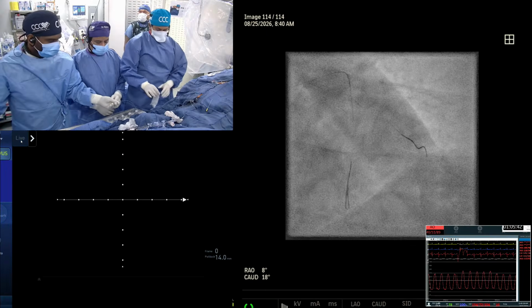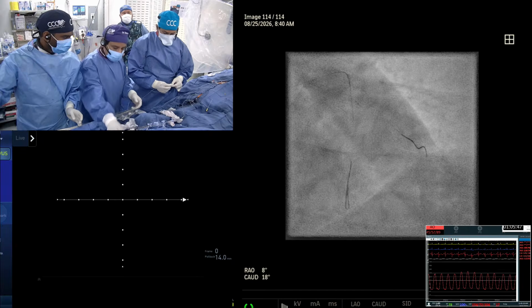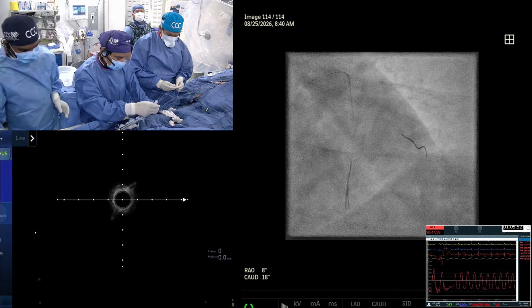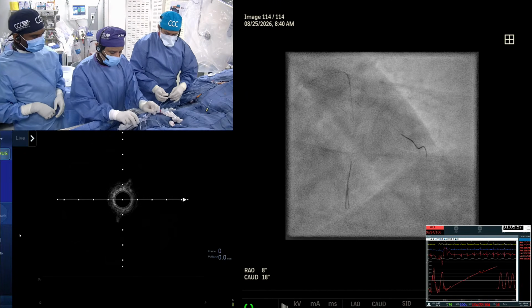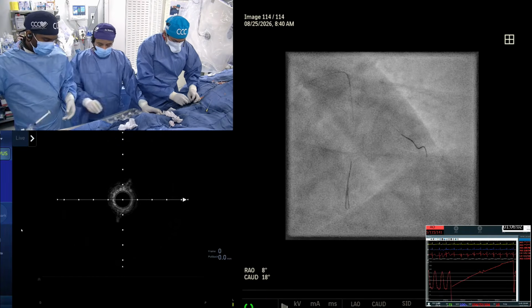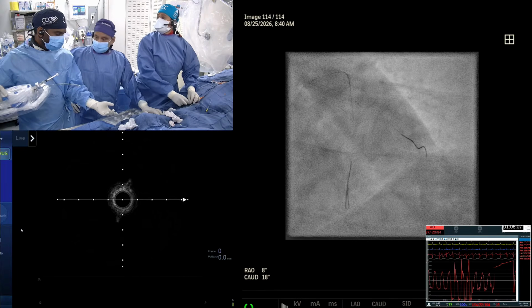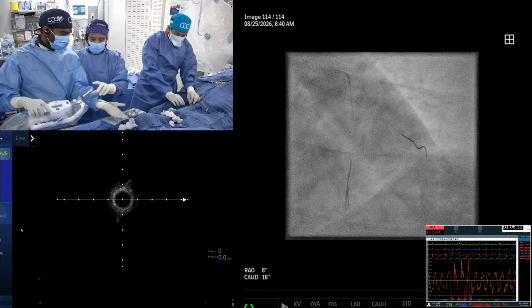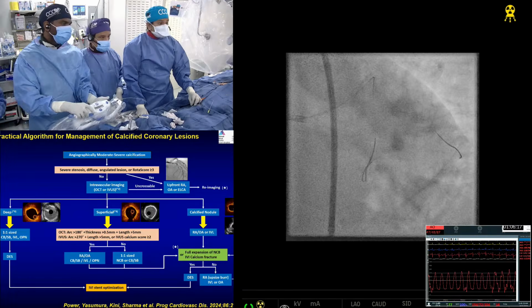That's question number 1, and I think we have mentioned and discussed multiple times, is understanding this arc of calcium around the nodule. That's the key. We can show you the nodule shock. Do we have that slide? Yeah, one slide of the nodule shock, and then if you can put up that algorithm which we had based on our previous experience. So this is an algorithm in the slide.